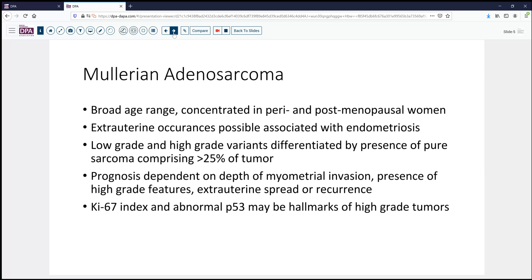This is an example of Mullerian adenosarcoma, which is a tumor that occurs in a very broad age range but is mostly concentrated in peri- and postmenopausal women. Extra-uterine occurrences are possible and typically are associated with a history of endometriosis. Sometimes prior radiation can also be an inducement or a risk factor for the development.